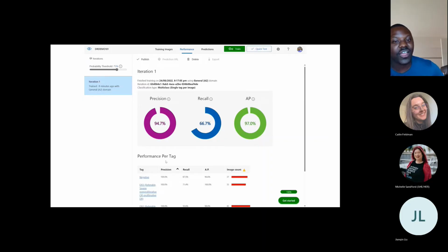It's just because of that repeatability, to have a representative sample, because you may have a high precision, but that's within the current data set that you use. And if you only use 37, there could be other images that you have not accounted for, and those may not be correctly identified just because your sample set was too small. And so that's the warning I get.